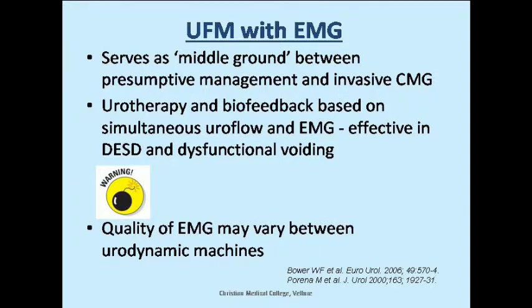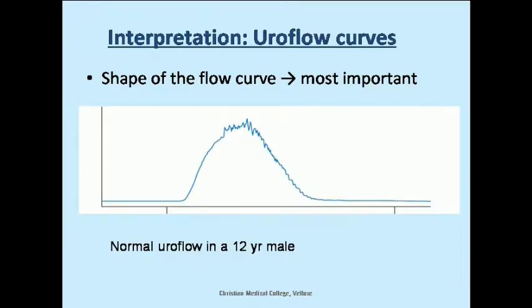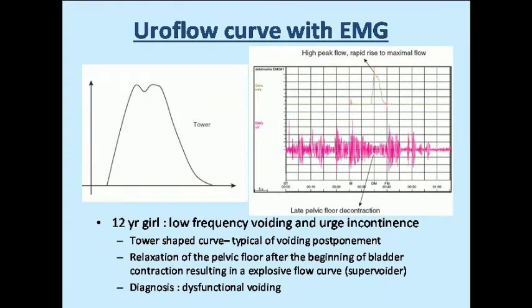They're not that easy to do, they're not always easy to obtain, so I usually rely on a video, which gives you the same information as EMG. But this is getting popular, and I think the reason is very simple: it is non-invasive, and it probably works as a middle ground between presumptive management and invasive diagnosis, and can also be helpful for biofeedback purposes. I think I will pass on this because the next speaker is going to talk about flowmetry.